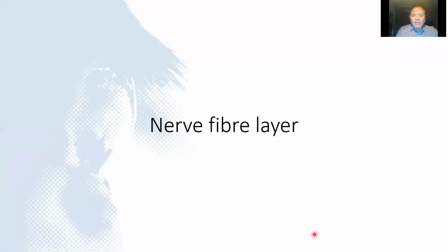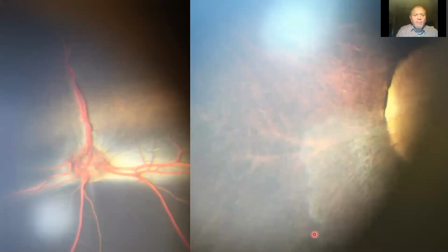Finally, before we leave the fundus, one of the things that I can only ever see with my phone is the nerve fibre layer. So this is another alpaca. We can see these white areas are myelination of the ganglion cells as they arrive at the optic nerve head. You can see those with the normal ophthalmoscope. This is a horse at the edge of the optic nerve.